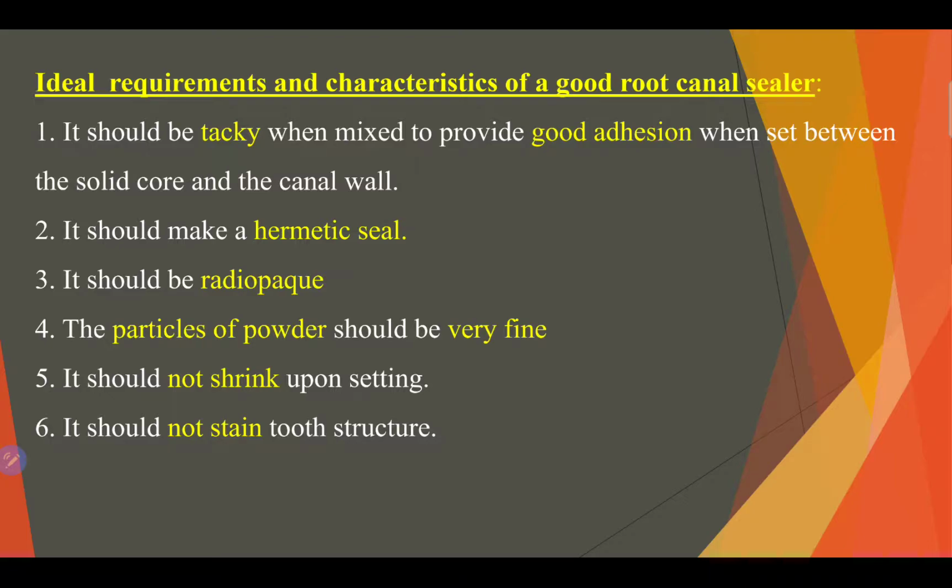It must have very fine particles to be dissolved, because if you use this bad sealer, the particles will stay between the cones and inside the root canal, and it will not make a very good adhesion. It should not shrink.